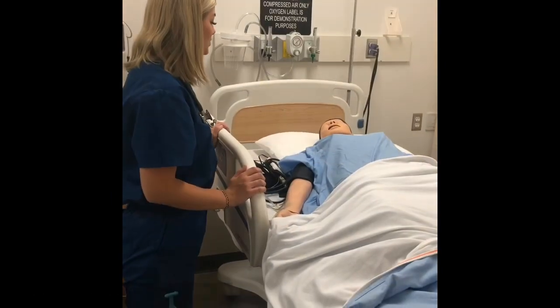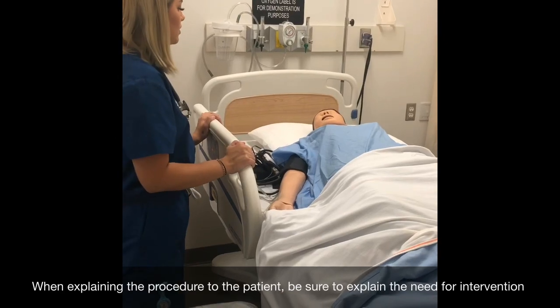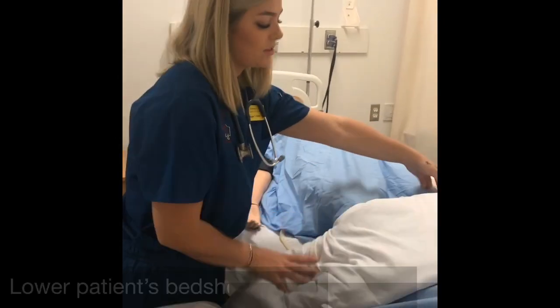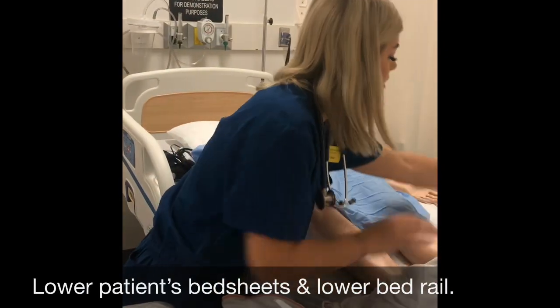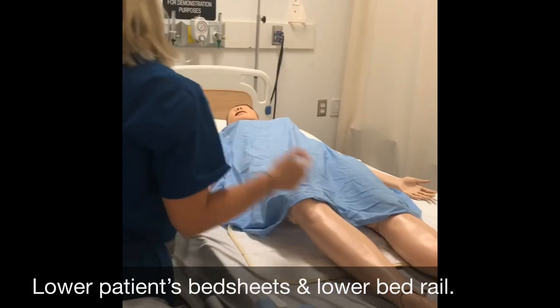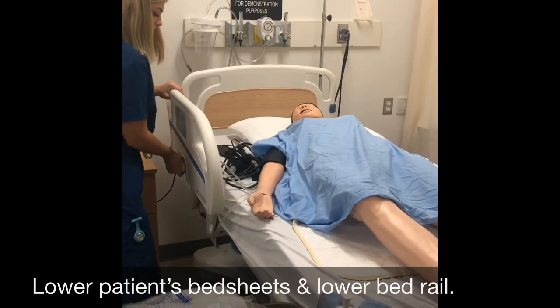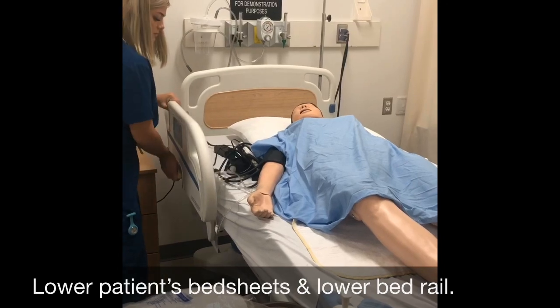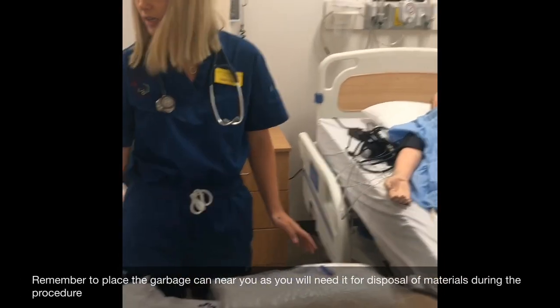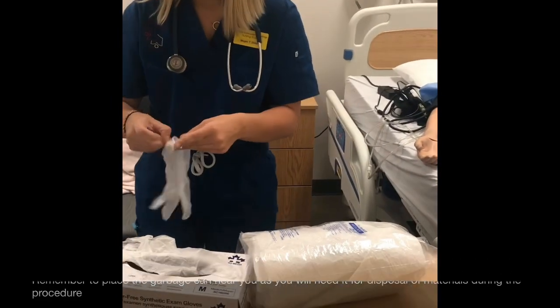Okay, great. So I'm just going to relieve some of that pain that you're experiencing today by inserting an indwelling catheter on you. So I'm going to start by lowering the bed sheets to the foot of the bed. Okay, and I'm going to lower the bed rail. Okay, gonna ensure my garbage is near me, and it is. So I'm just gonna go ahead and put on my gloves.